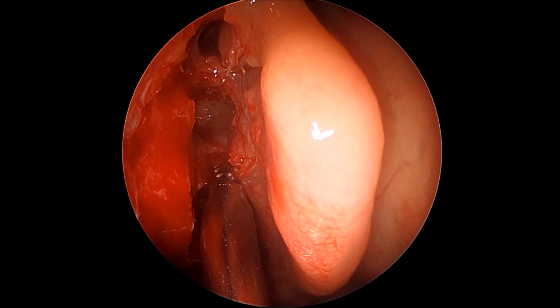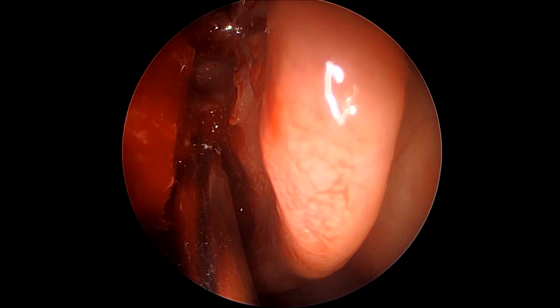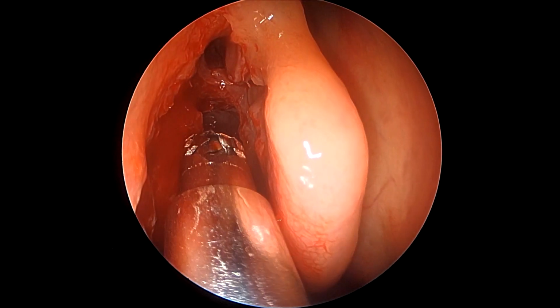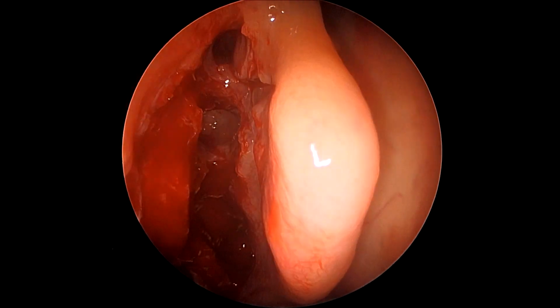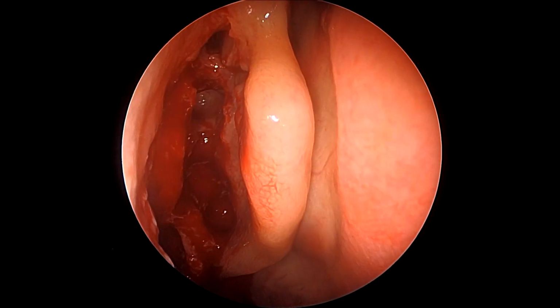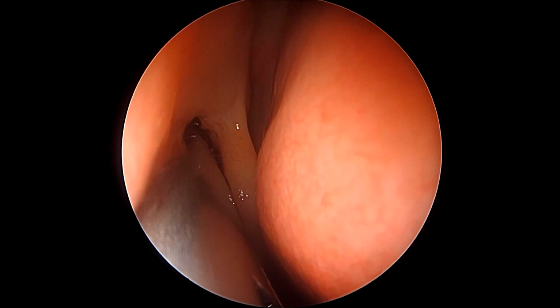Since this is a primary surgery with not much disease in the right side frontal sinus, we shall be quite alright with just opening the frontal recess adequately without doing any instrumentation in the frontal sinus proper, because that ought to induce scarring. However, in case of a revision surgery or gross fungal disease or access to the lateral frontal sinus, we may need to enlarge the frontal sinus ostium considerably.